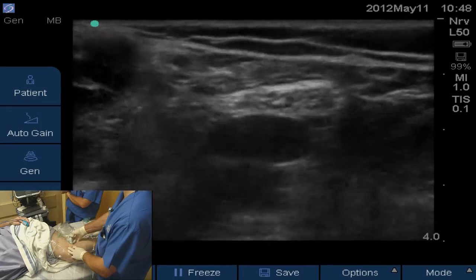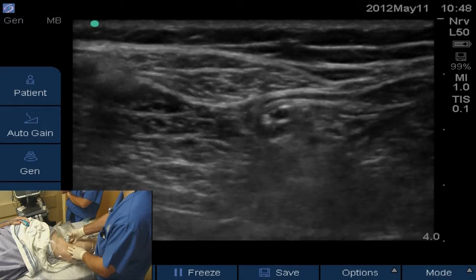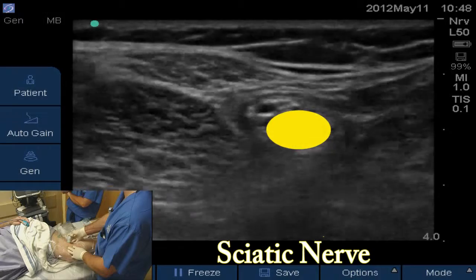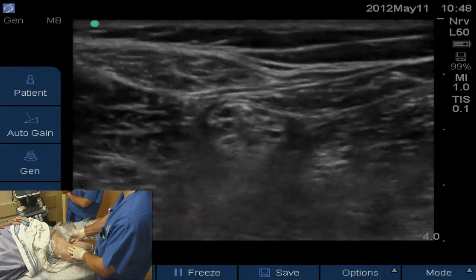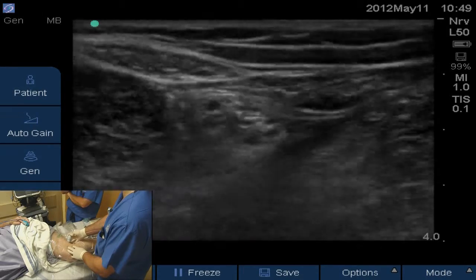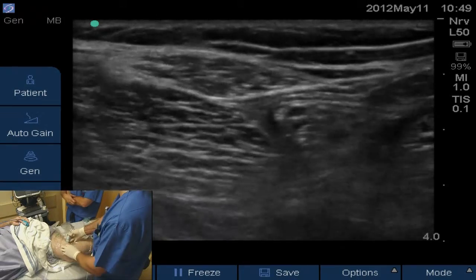We're going to slide really fast up the leg until it joins with the peroneal. Right there in the center of the screen is the entire sciatic nerve together — tibial and peroneal. Scan down the leg, you can see the two separate; back up the leg, see them come together. We're going to block it right at the juncture where they come together, and that's where we're going to do our catheter.